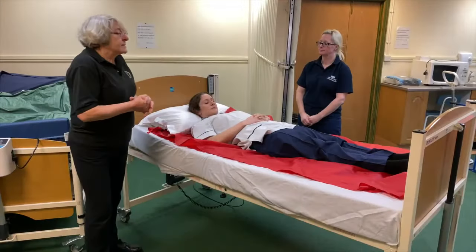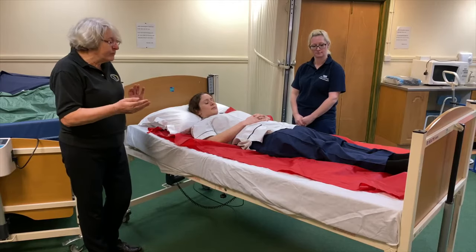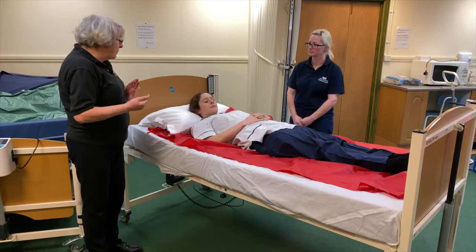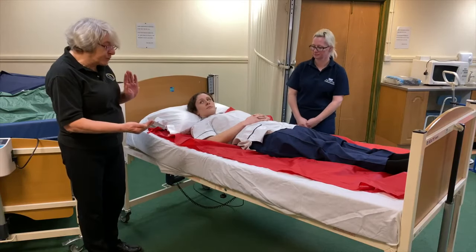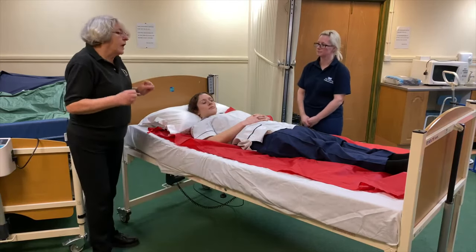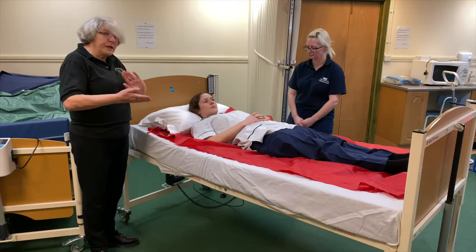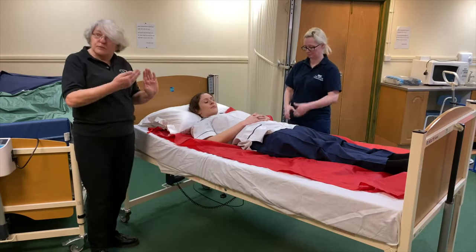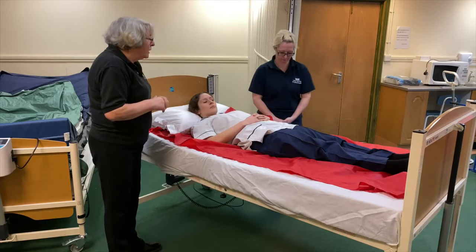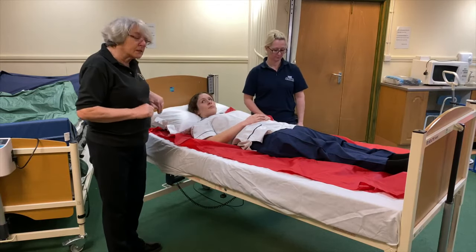Right, Alice has slipped down the bed a little bit. We have put the slide sheet in. We are now going to take her up the bed so that if we do need to profile the bed, her hips are going to be in the right place. So we're going to do supine slide up the bed. Supine is lying flat on your back and going up the bed like that. So Alice is in position. Lisa and I are just getting into position now. And we are coming to the top of the bed.